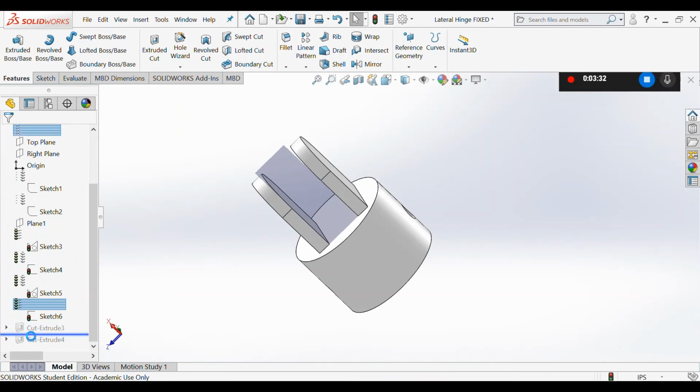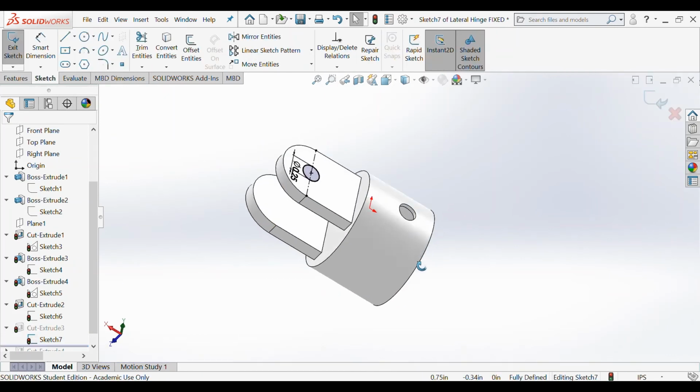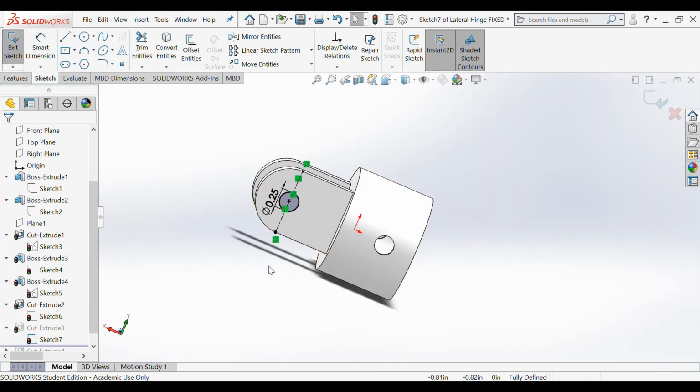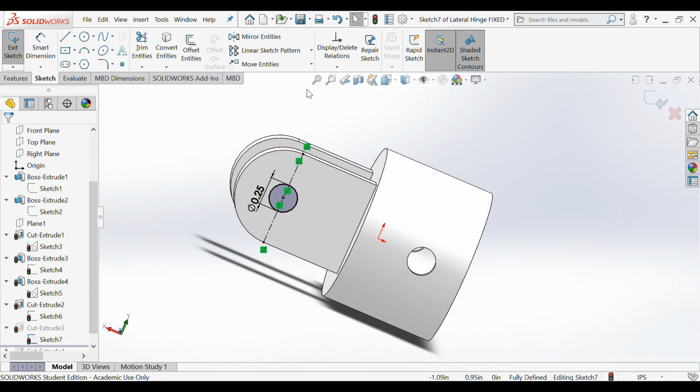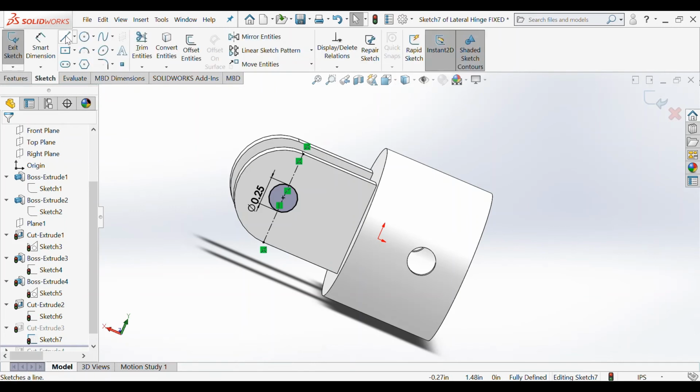Next, we will create a new sketch on the surface of this face right here, and we're going to go ahead and first make a reference line. So you're going to go to sketch, line, and center line, and we're going to draw it from this point to this point where the straight line of this surface and the curved line of this surface meet. Now this will allow us to center this circle right here in the middle of the two lines. We're going to choose this diameter to be 0.25.